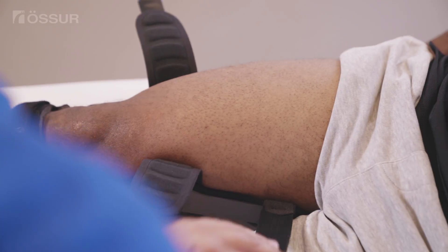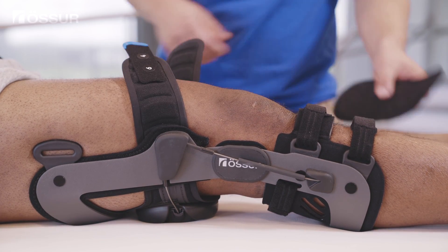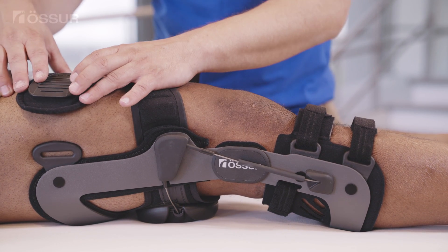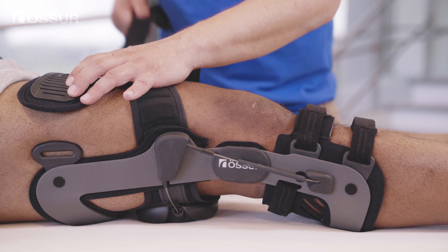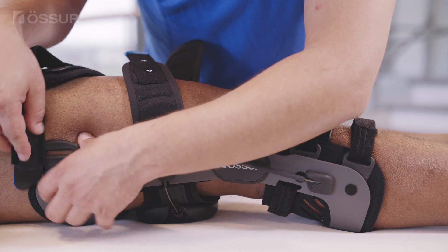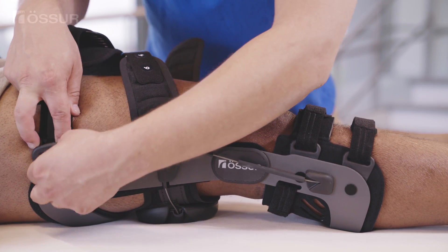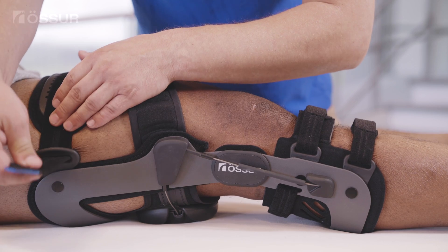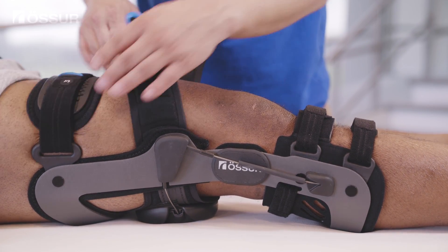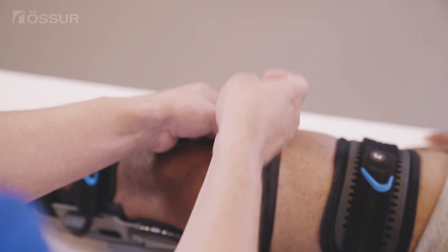Next, snugly fasten the proximal thigh strap and position the strap length. For optimal fit and comfort, ensure the strap pad is centered on the leg. Set the strap length and snugly fasten the distal thigh liner strap.